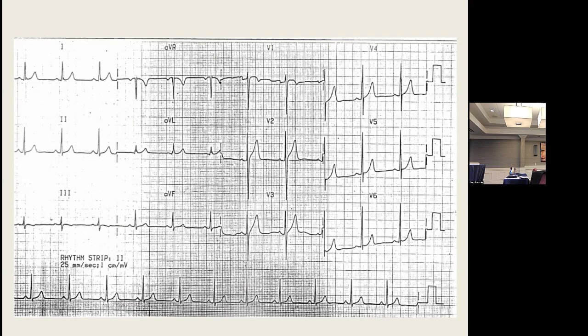But I'd like you to just know and identify this in a young person. This is early repolarization abnormality. Common, I see so many of these people get alarmed in the office and, you know, calm down, patient's okay. Just early repol.